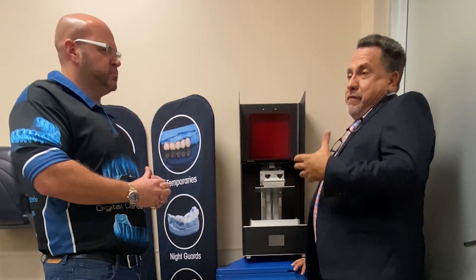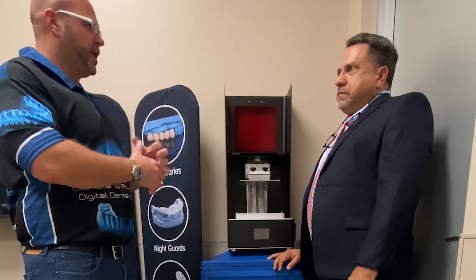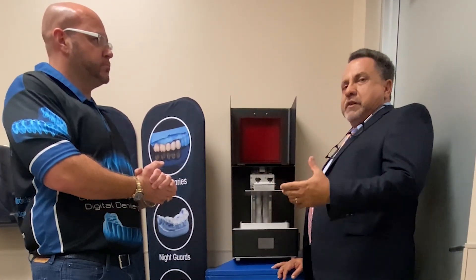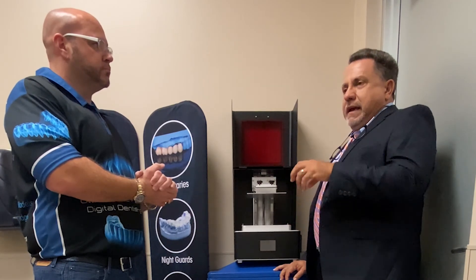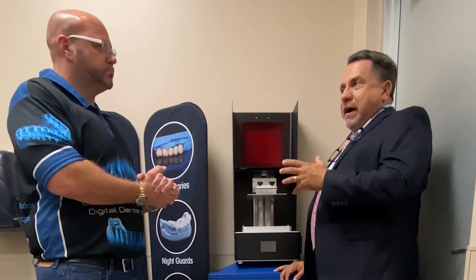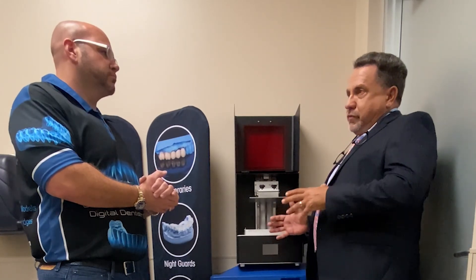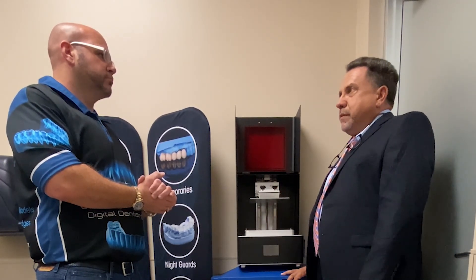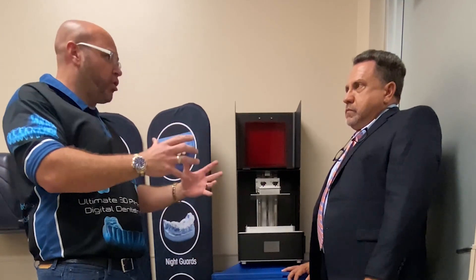For a dentist looking to get started with aligners using this printer, one of the best ways is to take the course we provide at DigitalEducators.com. We have several courses throughout the year — there's one coming up in December down in Davie. In that course, I show you how to use the software to create the aligner steps, the models, and then how to print them on this printer and go through the whole process of creating aligners for about a tenth of the cost of Invisalign.